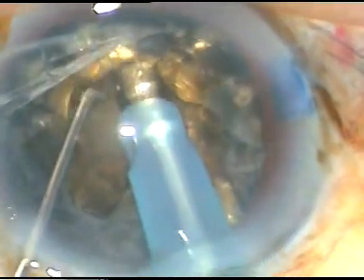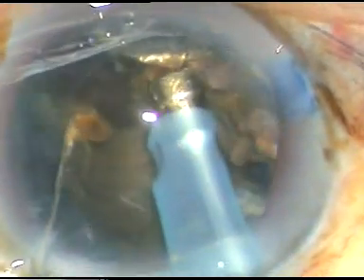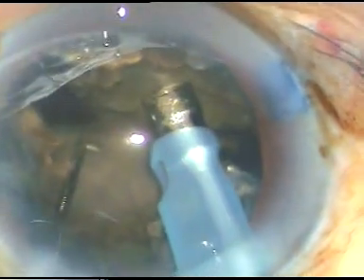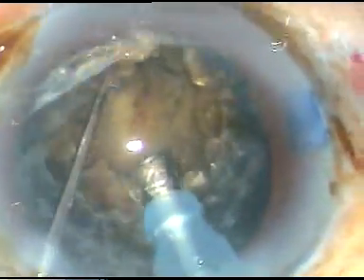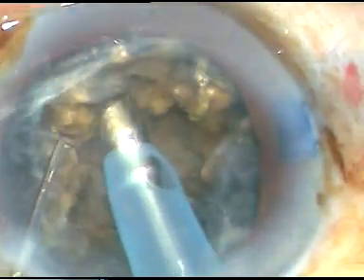And I never get wound burn. I never cause endothelial damage, because I use energy only when I have to emulsify something — otherwise I just stop. At this time I have rotated the nucleus 180 degrees and I am trying to separate it. It has separated almost, but at one point it is still attached. I didn't try to separate it further because I am causing a lot of zonular stress at this time. So I rotate it — and this is one hemi-nucleus. I am trying to divide this hemi-nucleus into two parts. Yes, I have been almost successful.